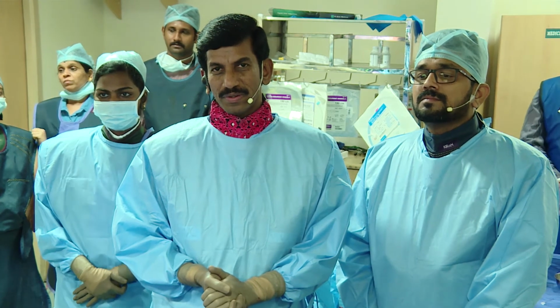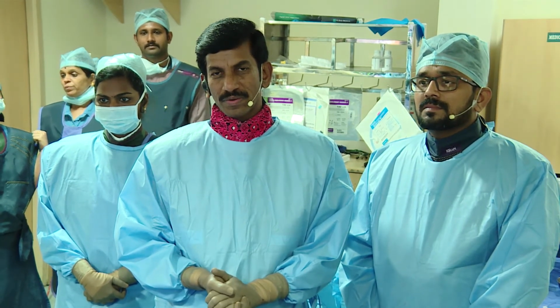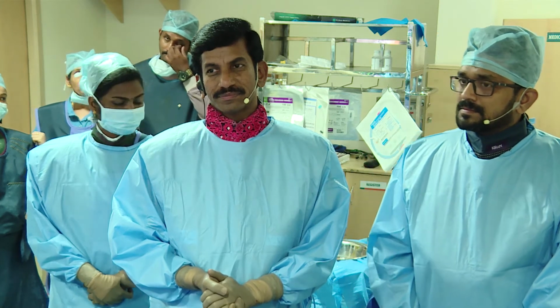If I had the patient, I would consider doing a gentle thrombus aspiration, because I think there can be a risk of distal embolization of this material if you wire and put an imaging catheter down. So I'll do a gentle thrombus aspiration and then maybe imaging to see if there's incomplete lesion coverage, if the stent is well expanded, if it needs an extra stent proximally, and if it needs further post-dilatation to get the adequate size for the patient.